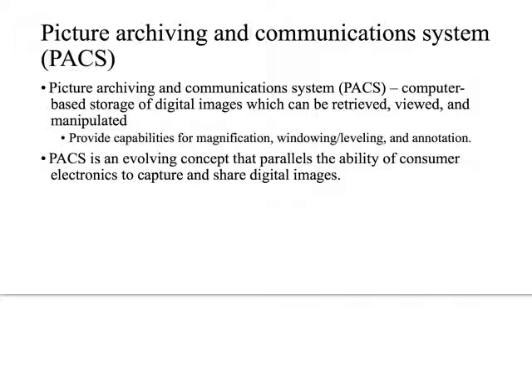But PACS will continue to evolve alongside consumer electronics, meaning that, for example, I can pull up PACS images on my iPad, or on my cell phone. And this is really driving a lot of, for example, physician order entry, even the development of artificial intelligence. Because of PACS systems, we now have AI systems that can do a general overread of images. So it could be in the future that the images that right now we send to the Nighthawk service are sent to a robot, and the robot does an overread and an initial impression, and then that is sent to a final human radiologist to do the overread, first thing in the morning.